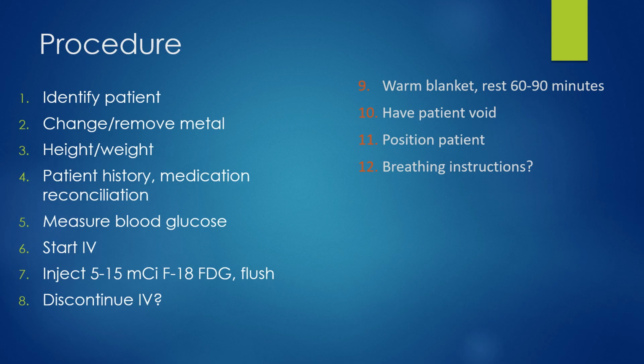It's just making sure they're comfortable. Give them breathing instructions if they need it. If you're doing a diagnostic or more comprehensive CT, then you may need to give them breathing instructions because they may need to do breath holds. But I will caution you that a PET CT scanner to a patient looks the same as a CT scanner. They may not know the difference.